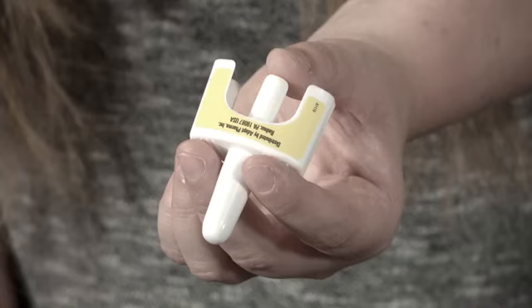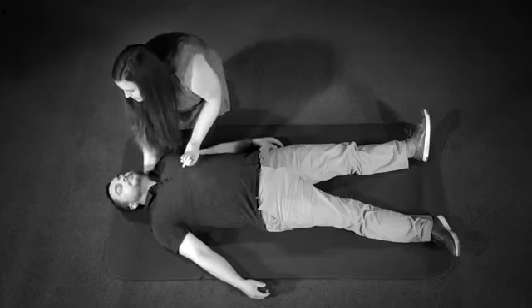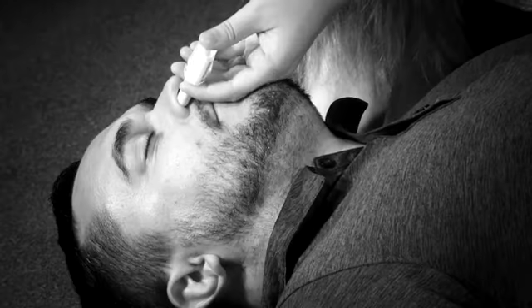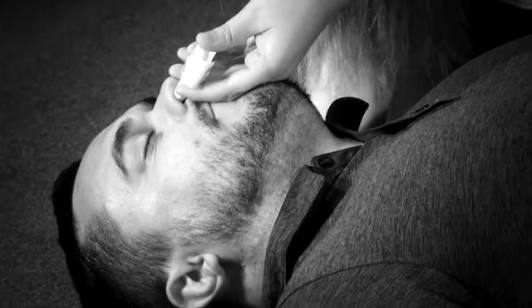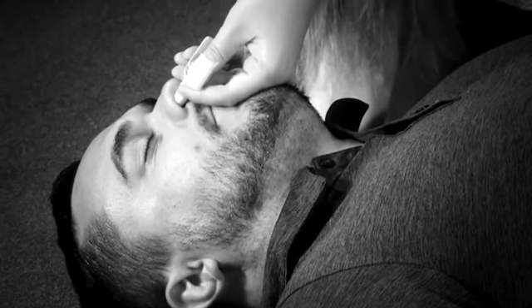For the Narcan nasal spray that we're using, hold the device with your thumb on the bottom of the plunger and 2 fingers on either side of the nozzle. Tilt the person's head back and provide support under their neck with your other hand. Place the tip of the nozzle in one nostril until your fingers touch the bottom of their nose. Press the plunger firmly to place the full dose into their nose.